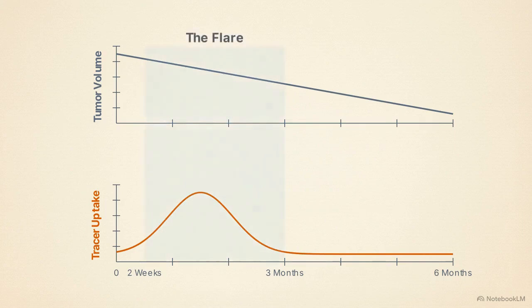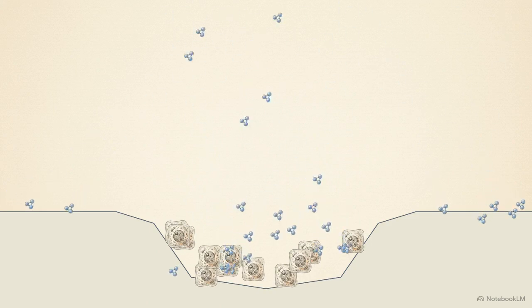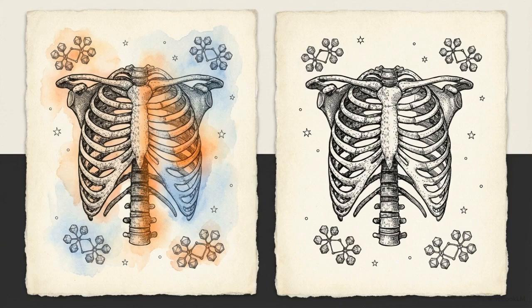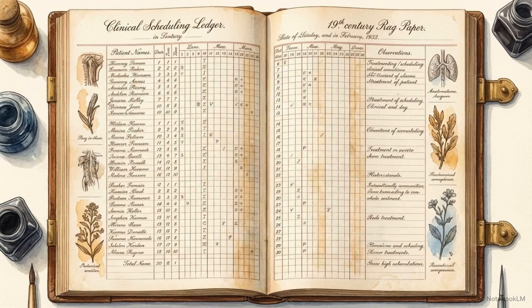This spike in tracer uptake is a robust osteoblastic healing response, not cancer spread. As chemotherapy destroys the tumor, the bone attempts to repair the defect, creating a high-volume sink for the MDP tracer. We verify this by comparing the scan to plain film radiographs taken during the same window. Plain films will show increasing sclerosis, confirming that the bone is fortifying and healing. To avoid this misinterpretation, standard protocol requires delaying definitive re-imaging until 6 months post-treatment.